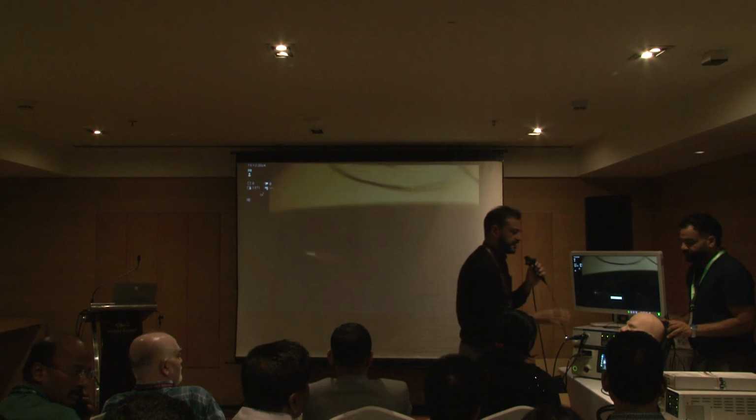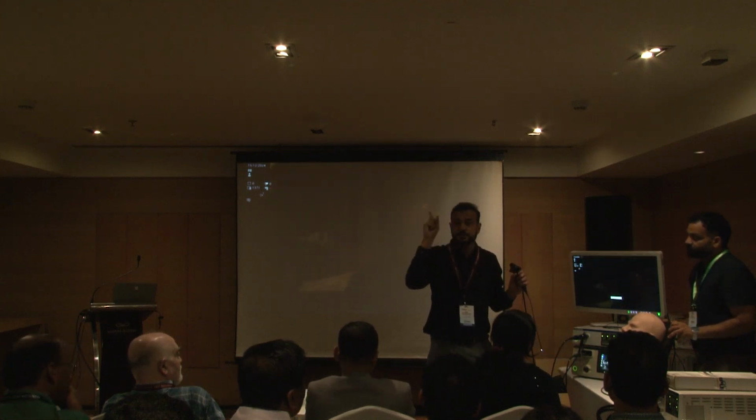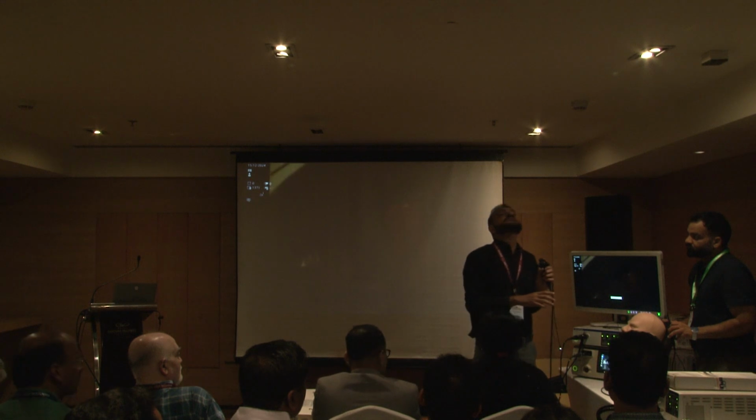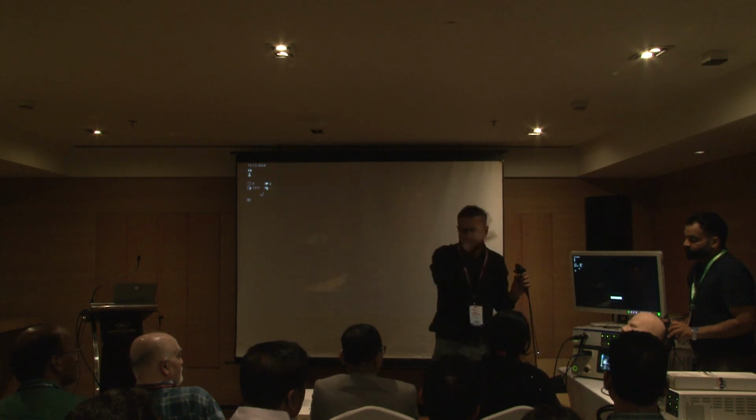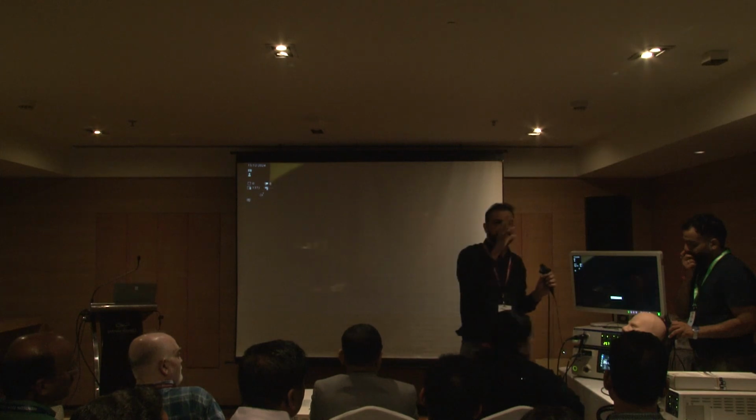When a patient is sitting, the position of the patient should be the same as when we use it in real scopy. Sometimes the patient is extended, sometimes flexed. All of us are doing scopy for foreign body coin removal. Always put it in the same position. The patient should be flexed at the neck and extended at the head, as when he smells something. So as the patient smells something, his neck should be slightly flexed and extended at the head. This goes inside. This is one important point.